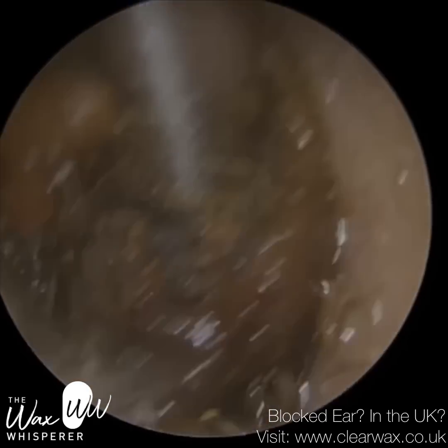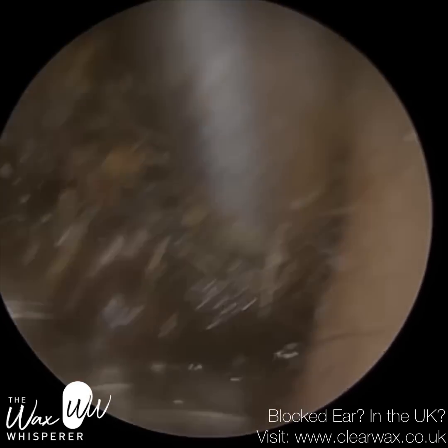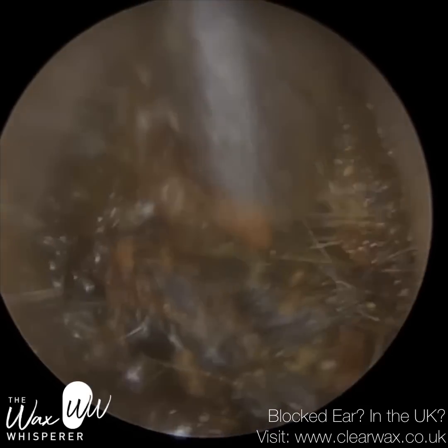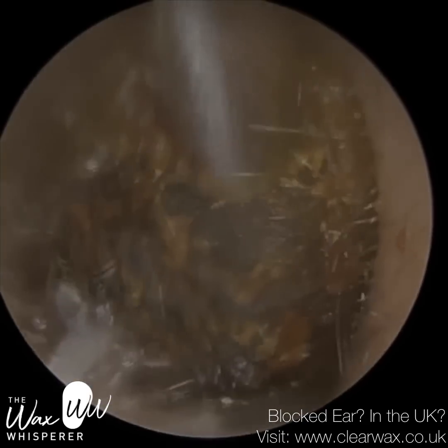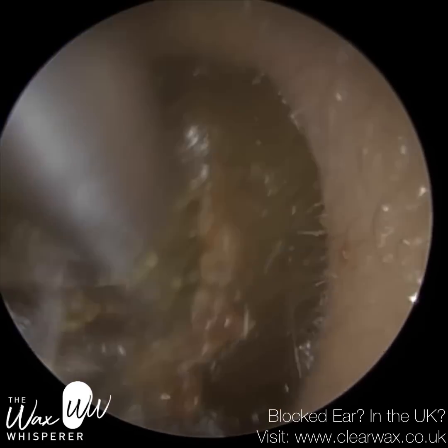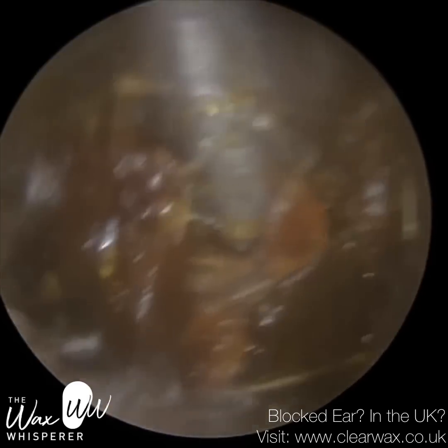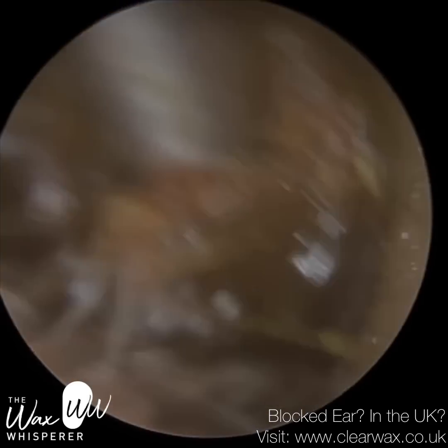A couple of times I thought I was just about to reach out for the ear hook, but it was coming through, so I thought against, and then eventually it did come away. See, it's coming through now. I'm just rocking it left to right, up and down, and we're just squeezing it through and out of the ear.